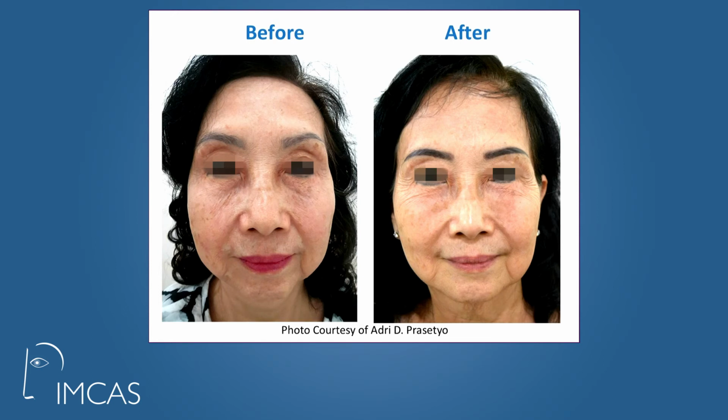But after I injected the total face, from the frontal, temporal, malar, and then the lower face, the pre-jowl and the chin, we can appreciate the secondary effect, which is skin stretching, and also the appearance of a pseudo lift, which helps to improve the patient's aesthetics.